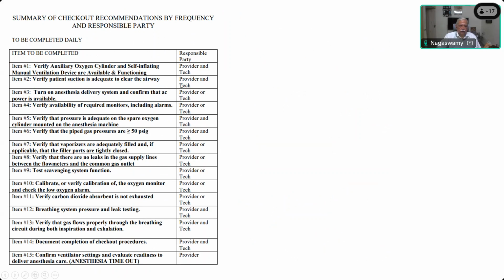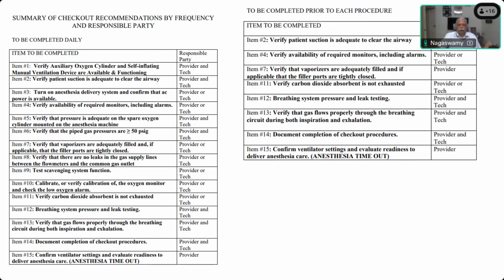Okay, so here this is to be added. Who has to be responsible? You cannot put the blame on the technician and say he was responsible. It is always the provider. Ultimately, if anything has gone wrong, it will be you who will be responsible. Only once you become a registrar or a consultant, you are going to be responsible for the mistakes of the persons working under you. So that is the reason why I'm again and again insisting that you better check it yourself, even if the technician has done their routine checking, and then these are all the things.